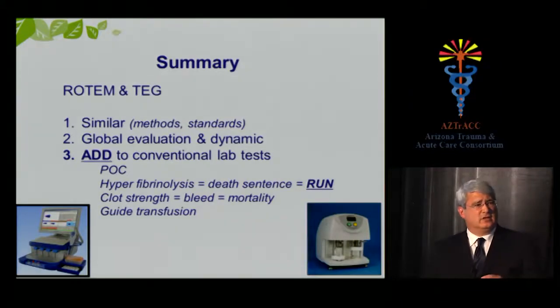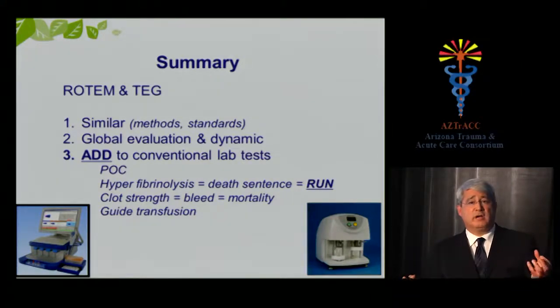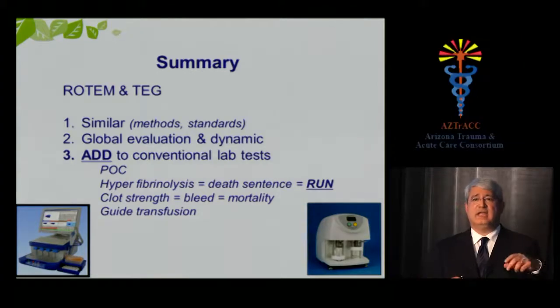So this is the end. What do I think about TEG and ROTEM? Interesting. Worthwhile investigating, worthwhile studying, worthwhile considering. They are not the solution to all our problems, not by a far shot. They're not perfect tests. I think they add to the current lab that we have. And the additional things that TEG and ROTEM give us is that they can show hyperfibrinolysis that no one else can, and also show us which patients may need blood and what blood product the patient needs.